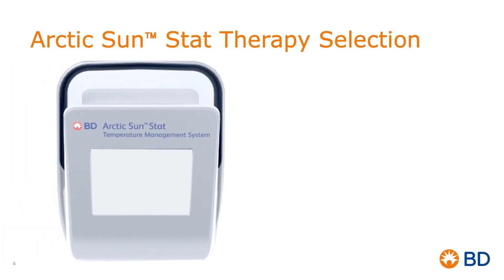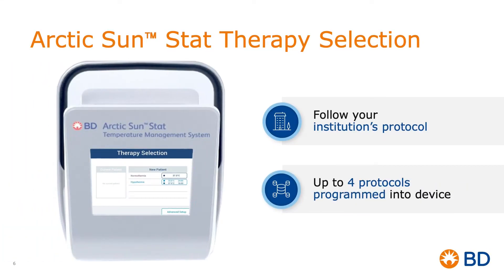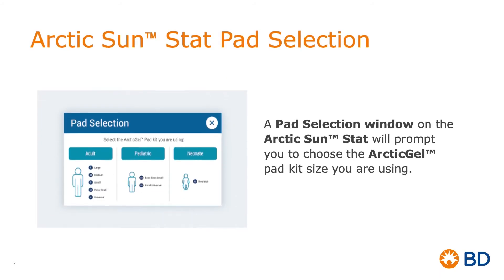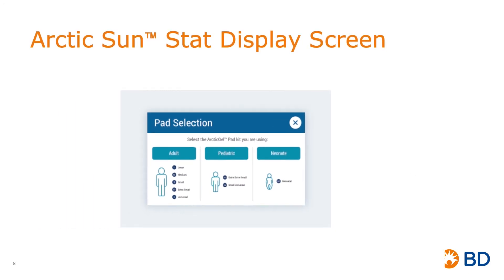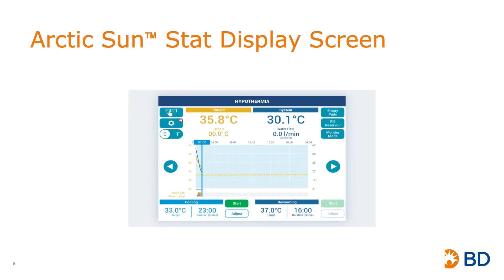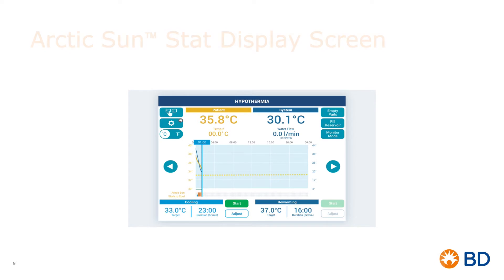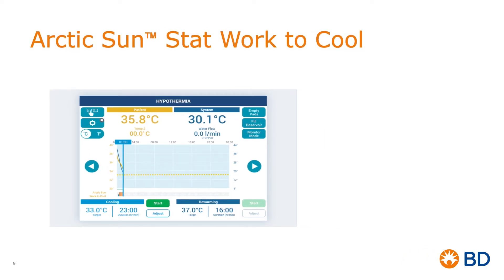The Arctic Sun STAT Temperature Management System stores up to four protocols in your device. When initiating therapy, select the protocol ordered, then choose the Arctic Gel Pad Kit Size for the patient being treated. The display screen shows patient information in yellow and water information in blue. The dotted yellow line is the goal of therapy as programmed according to your hospital protocol.